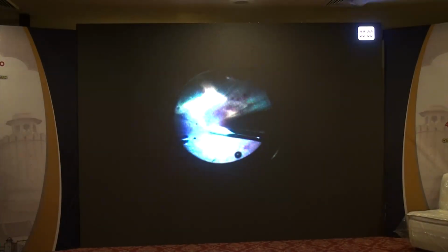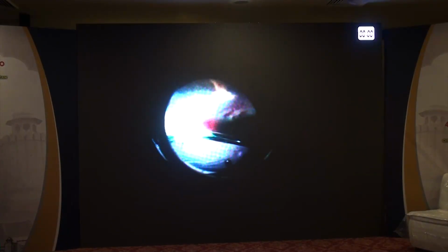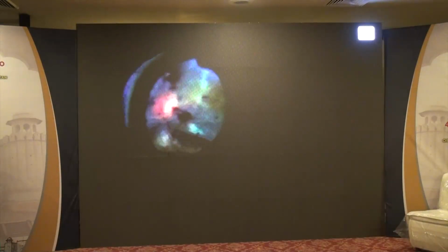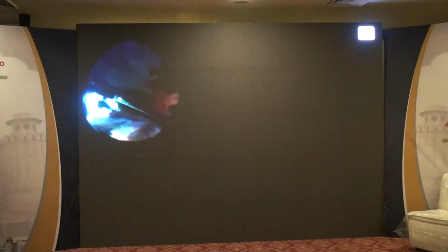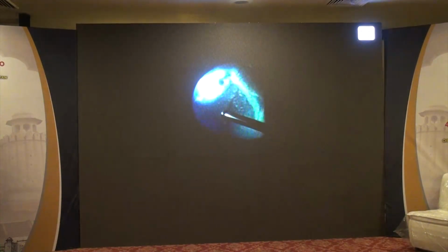Now this is all pre-retinal hemorrhage which I'll be able to remove. So the cutter in this situation is cutting and aspirating alternately. There was a huge amount of yellow subretinal fluid. Obviously, we all know that when you develop exudative detachments, you always get yellow fluid.